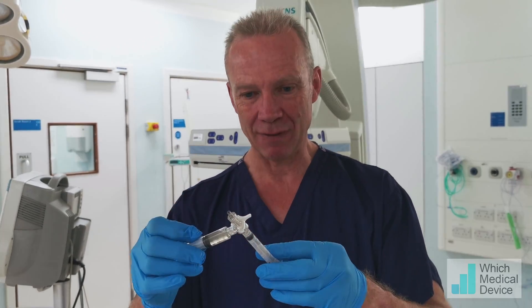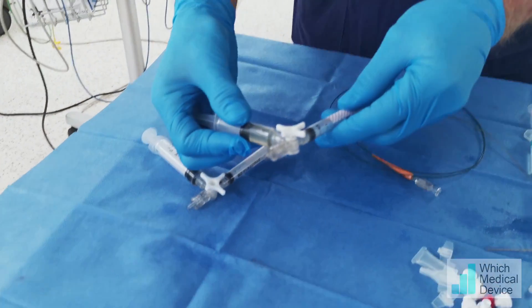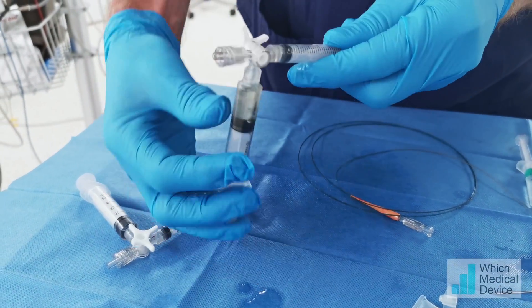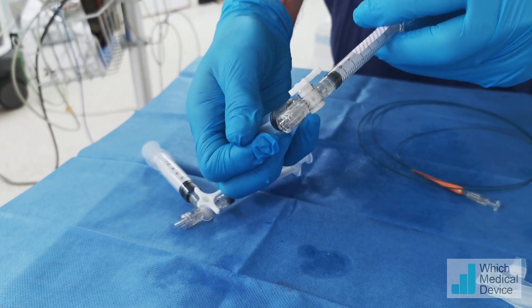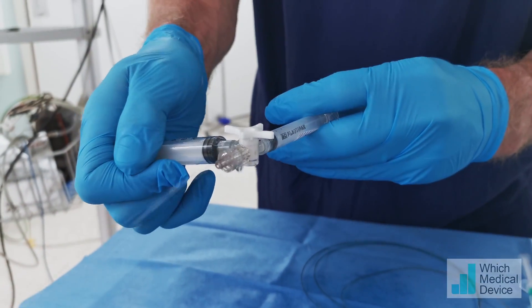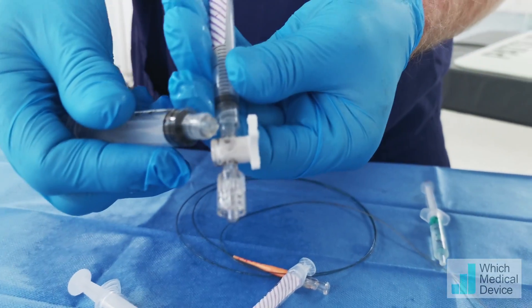Now if you just come closer and have a little look, we'll try and see where this is broken. I think it might have actually broken the hub, or is it coming from underneath here? And this is one from earlier, and this is leaking even more. There you go — it's broken the hub clean off.